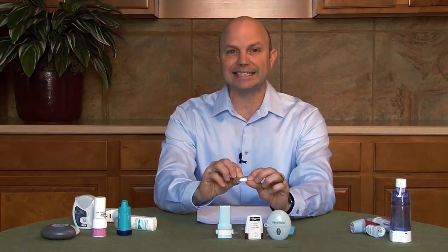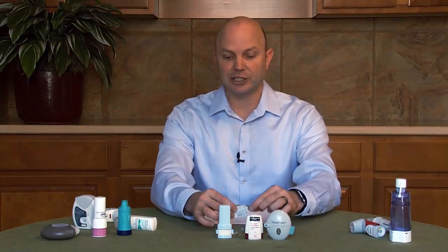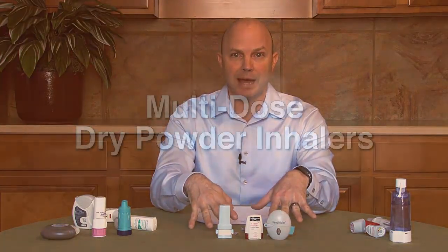Another thing to note with the capsule is that the medicine inside may cause a skin irritation, or if you touch your eyes, might cause your eyes to become fixed and dilated. So it's always a good idea to wash your hands before and after you take all of your medications. The medications that cause the dilation of the eye are known as anticholinergics. But again, it's a good general practice to wash your hands after using any of these blister packs.